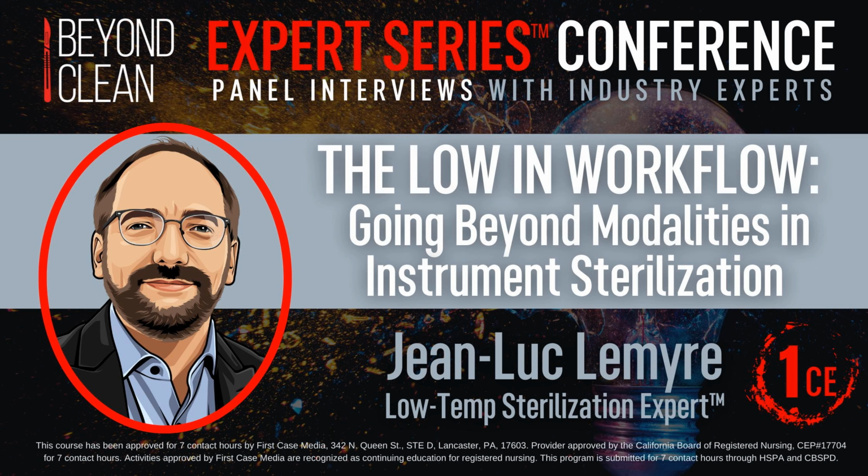Yeah, there's a lot of different things. From a user perspective, depending on the facility and type of scope, it may add some complexity to the process, or there might be a need to change process in SPD to get there. Another important consideration is the design of flexible endoscopes. Some are well designed for low temp sterilization, and some were designed with high level disinfection in mind. So this is obviously something that takes a significant amount of time. Flexible endoscope OEMs should spend time on the next generation of products, designing them to sustain low temp sterilization. And obviously working with low temp sterilizer manufacturers would definitely help that process. So having collaboration would be very important to get there.